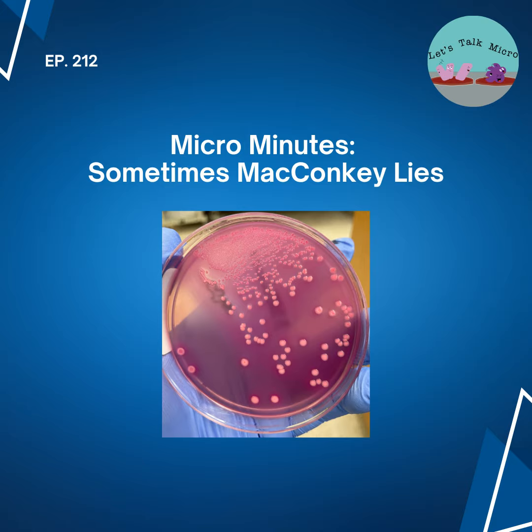And this is something that unfortunately I have seen in the lab. Sometimes people don't do a gram stain. They assume that it is not a gram-negative rod. They set up, let's say, a gram-positive card on the Vitek, for example, and they get something like Kocuria. That ID you have to be careful with, because when you set up a gram-negative on a gram-positive ID card on the Vitek, you will get this Kocuria ID.